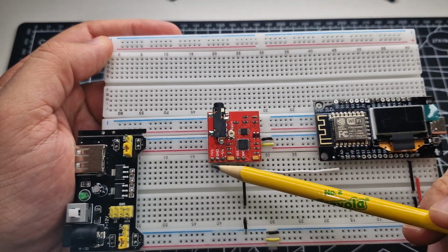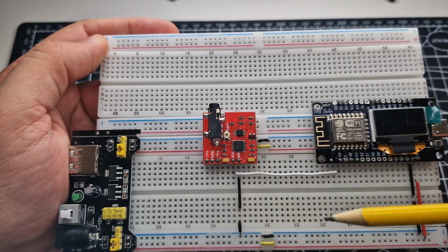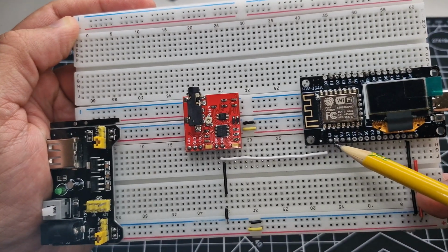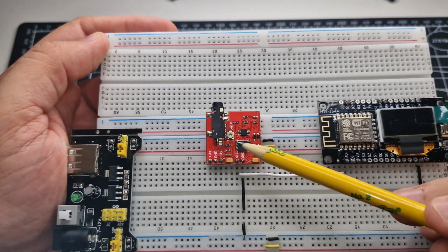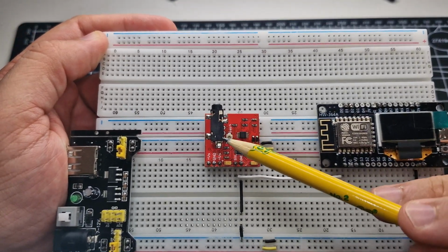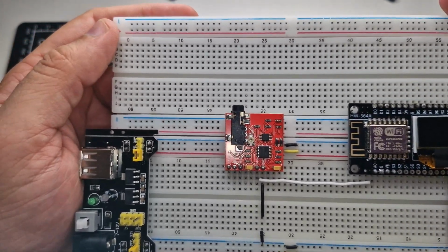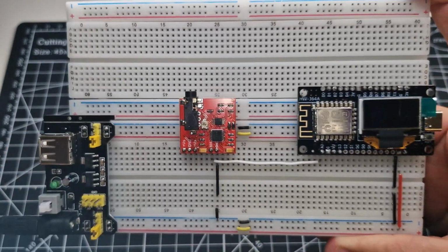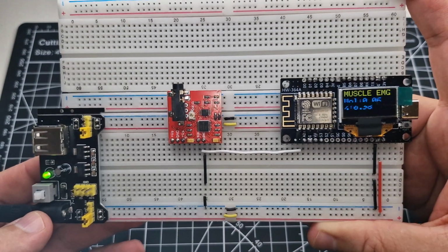These are the power pins and the output pins. It will be connected to the analog input of the microcontroller and displayed on the screen. The sensor output has its GND pin or reference. This should also be connected to the microcontroller's GND. It also features an improved adjustable gain, an integrated port for new cables, and reduced voltage requirements. This muscle sensor can be used to create muscle-controlled interfaces for various projects.